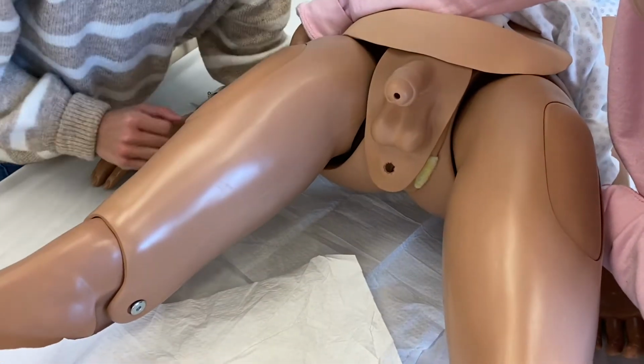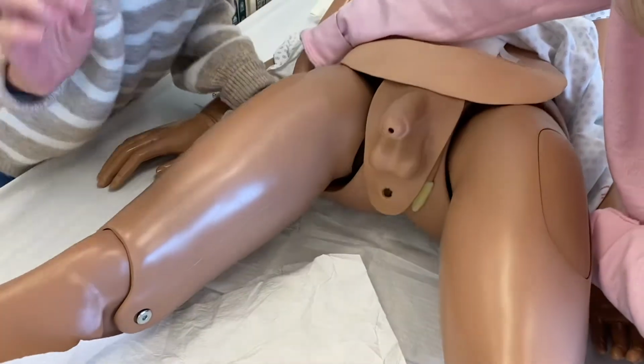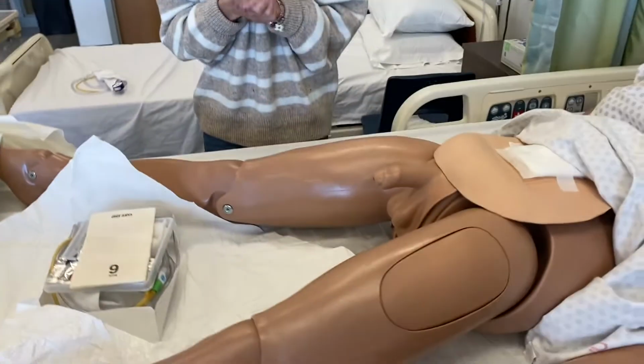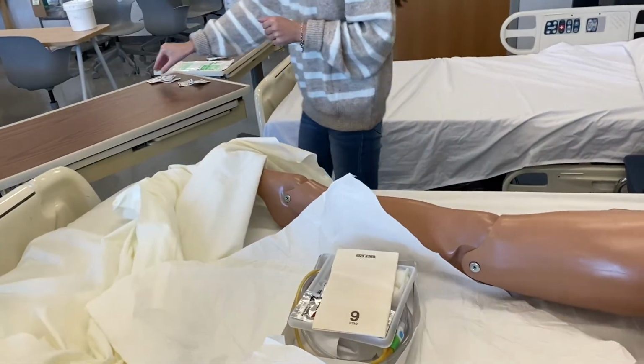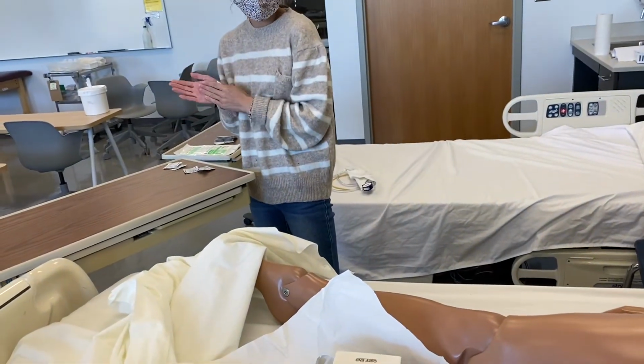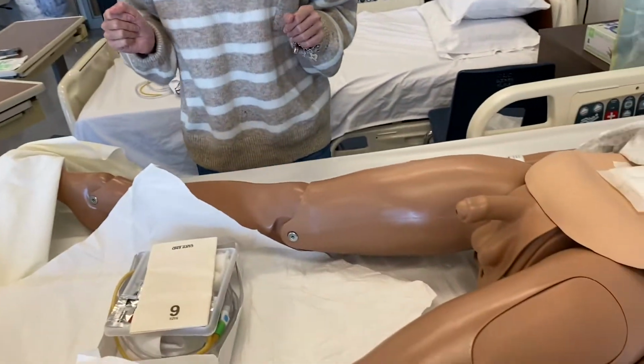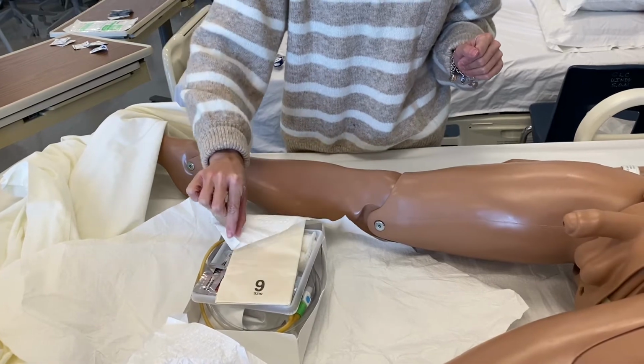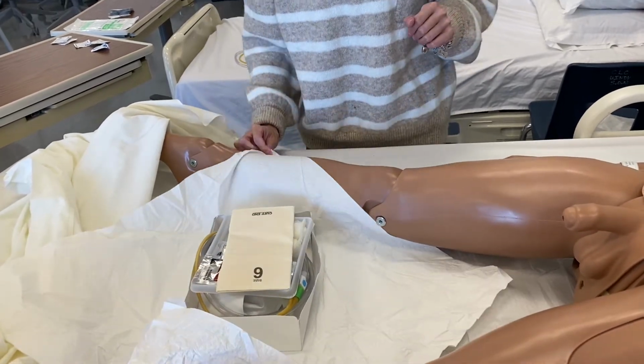Okay. So I did cross over my sterile field right there to get that under there. That would be considered contamination, and I would start over. Perform hand hygiene. So I touched my shirt. Alright, I'm going to open that back up.